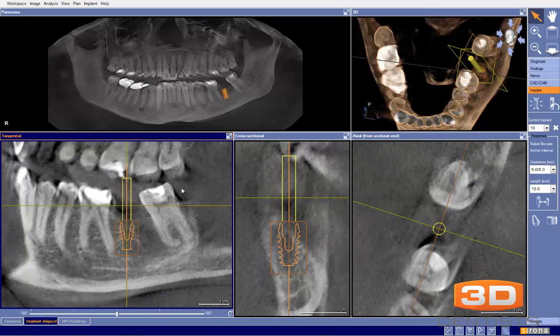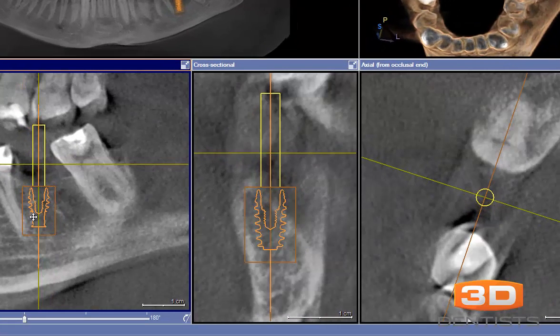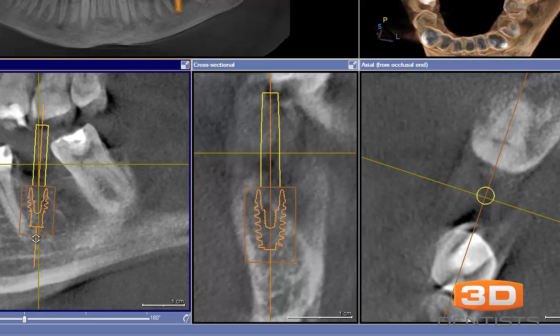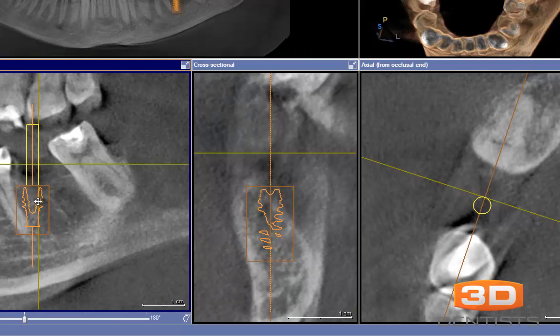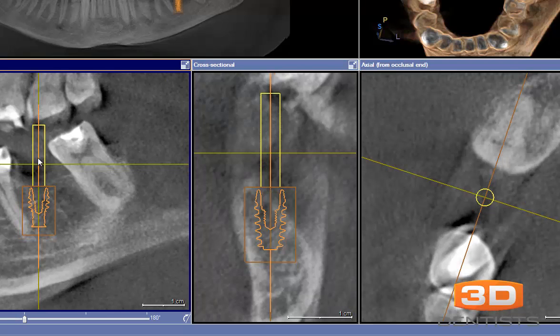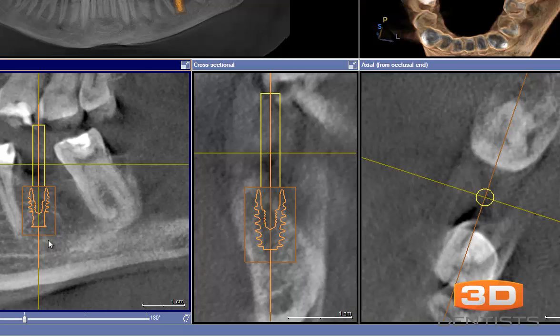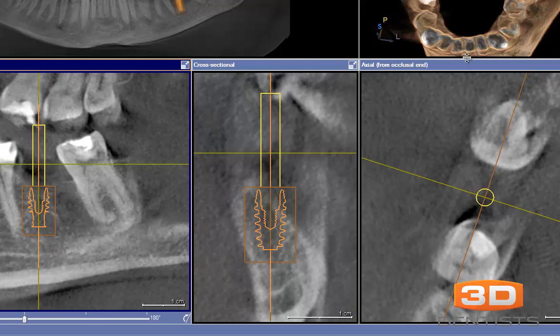And you'll notice that my occlusal plane is definitely pointed a little bit up, but that was done because of this large diverging root here on the first molar. We didn't have the ability to get this correct, because to get it correct we would then need to place that implant into the root. So instead we simply chose to accept a compromised implant position in this particular case.